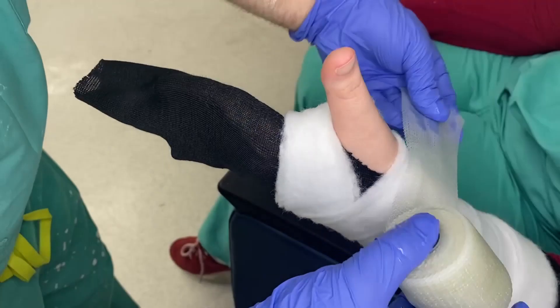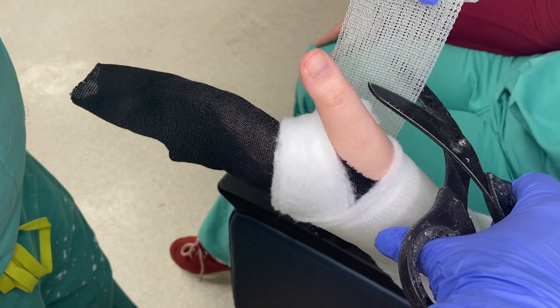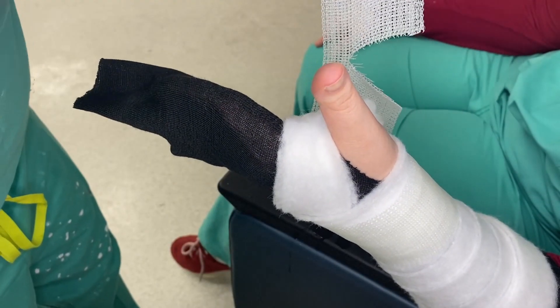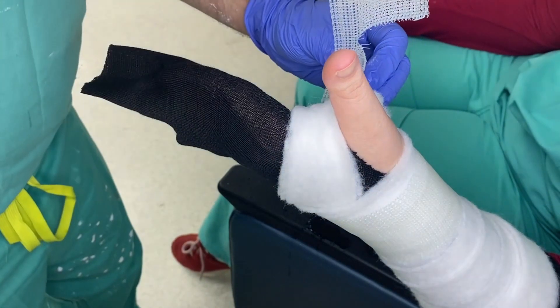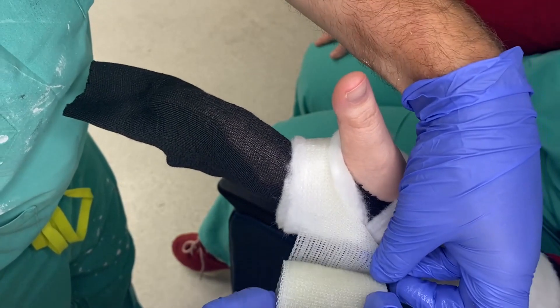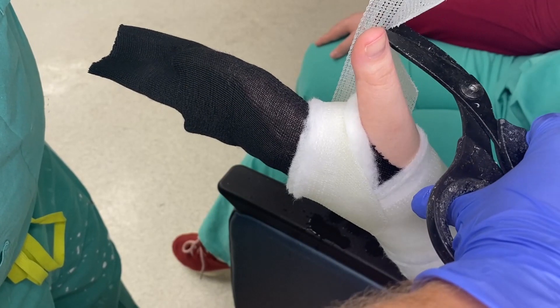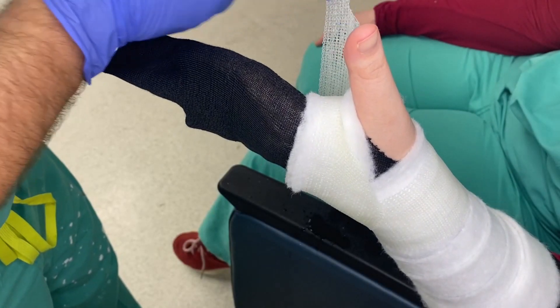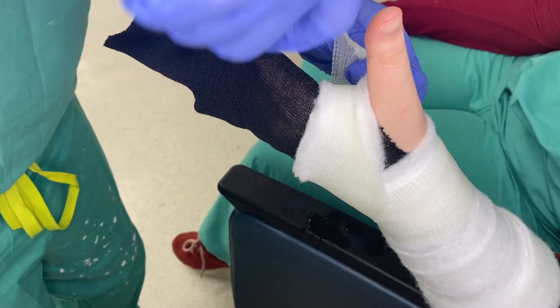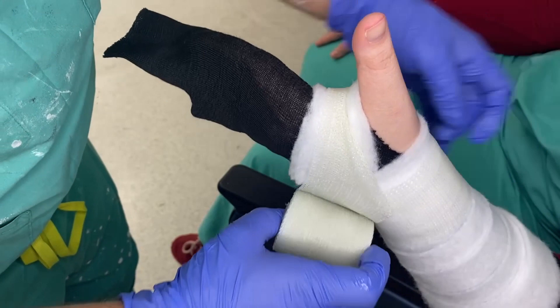This is how to correctly roll around the thumb for casts. Usually for casts I start around the wrist. Pull up your fiberglass and cut right at the thumb, cutting away from the patient, all the way to the edge — usually when you have about a half inch left. Then fan fold on the back side, twist about 180 degrees, come back, and fan fold on the other side. Those cut sprigs all become sharp, so you want to protect the patient's skin: fan fold, twist 180 degrees tucking all those sprigs in, come back and fold that edge, then go down 50-50.